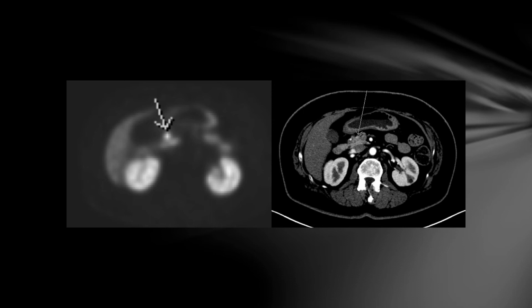And the extent of this wasn't really expected on CT. As you can see, this is a portal venous CT, so this is one of the phases of CT imaging that we do. It shows only a small area of abnormality within the right lobe of the liver and really underestimates the volume of metastatic disease.